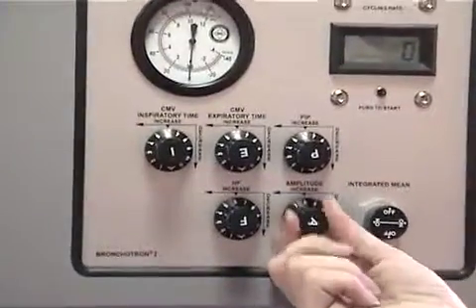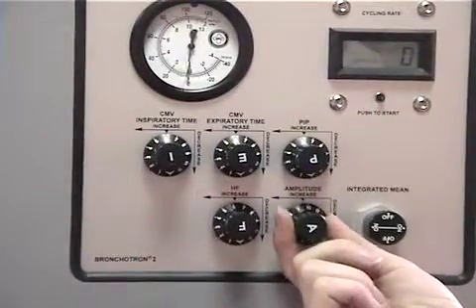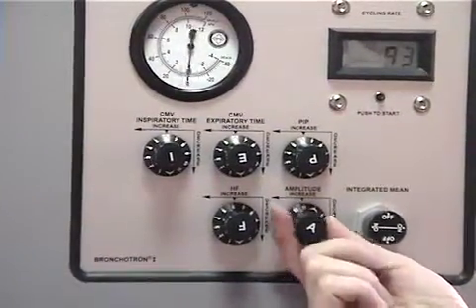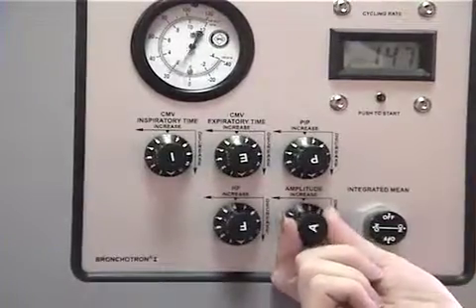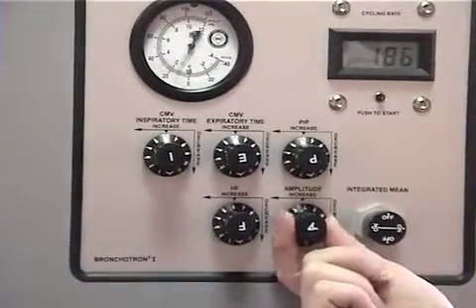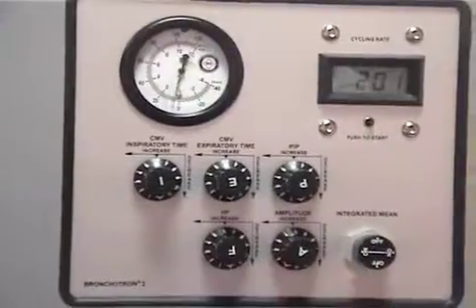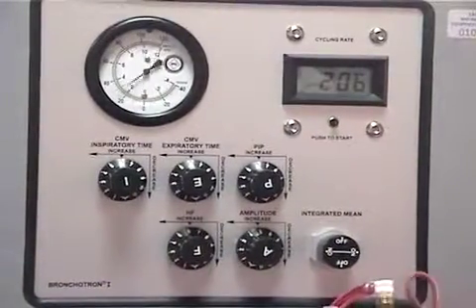The Broncotron has two controls for high frequency ventilation, an A knob for amplitude and an F knob for frequency. You will also notice that all of the conventional ventilation controls are turned off.